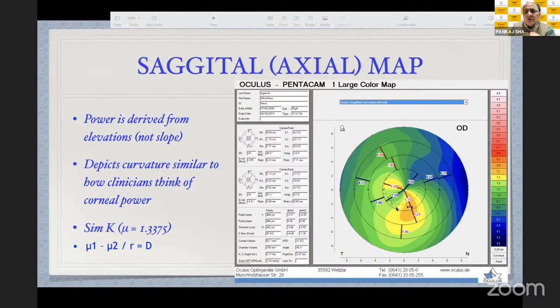It is a generalized map. It will not show small changes in the corneal contour. Isme important hota hai, if this bow tie or astigmatic bow tie, which is formed, whether it is skewed or asymmetric. Here you can see that the lower part is very large and the upper part is very small, and also they are not in one straight line. So skewed radial axis and this bow tie, which is asymmetric, could be a case of keratoconus, but sagittal map is just a generalized map.